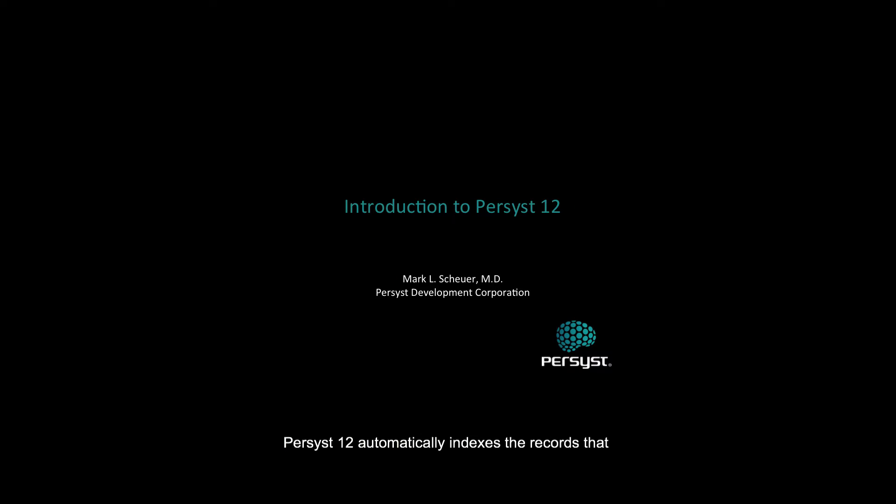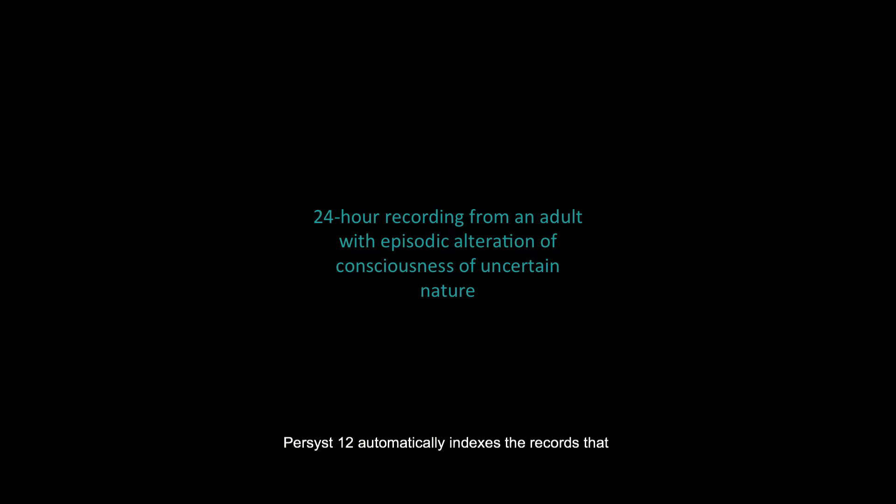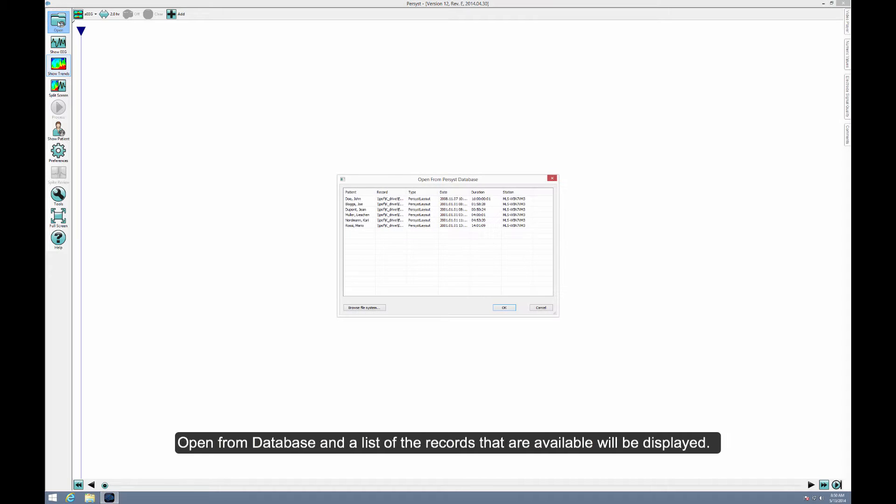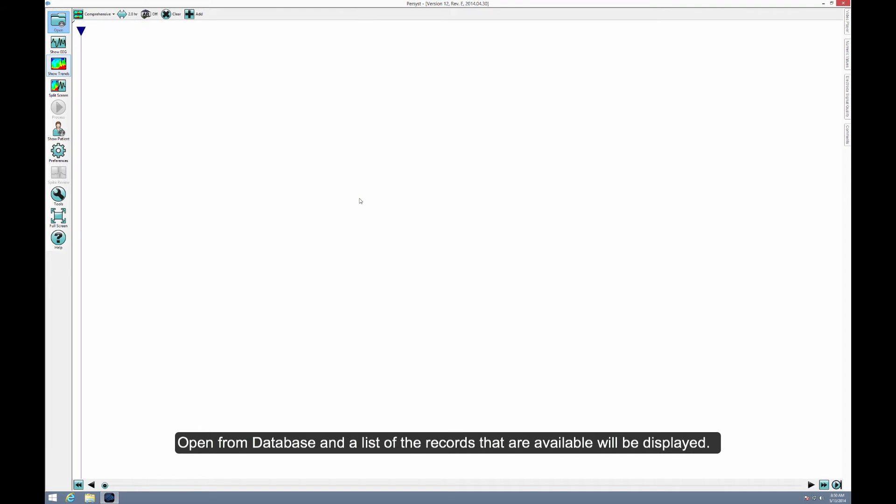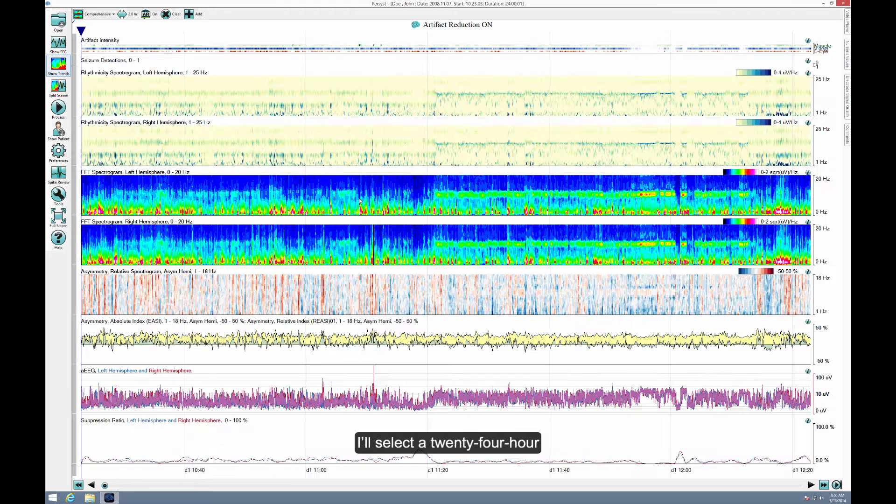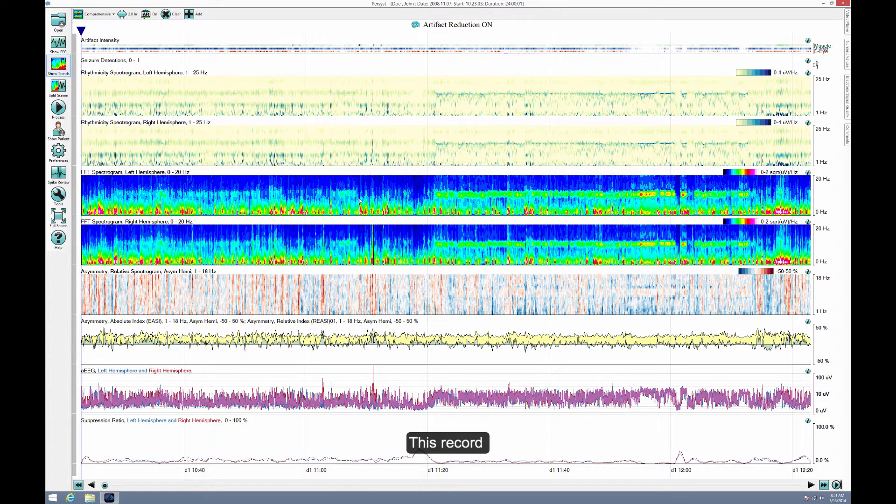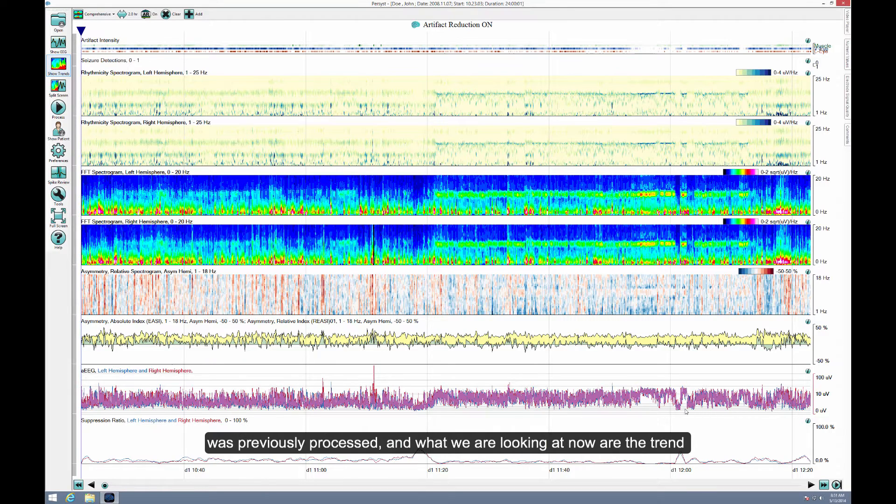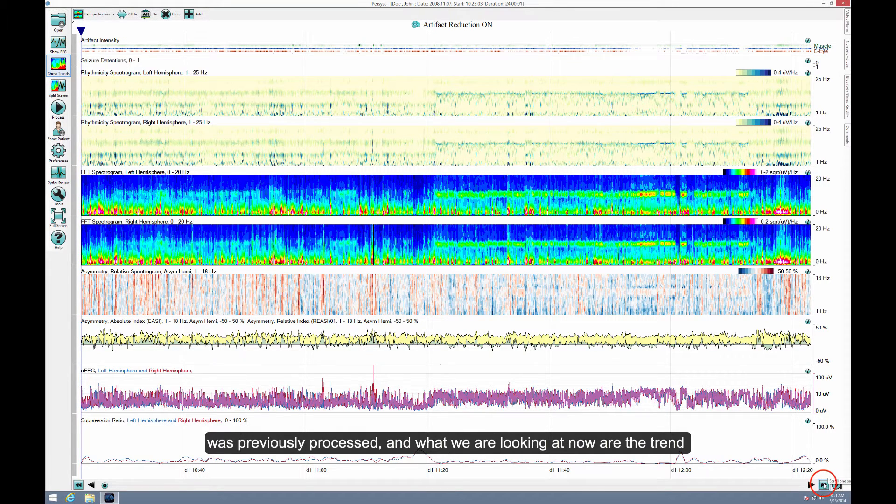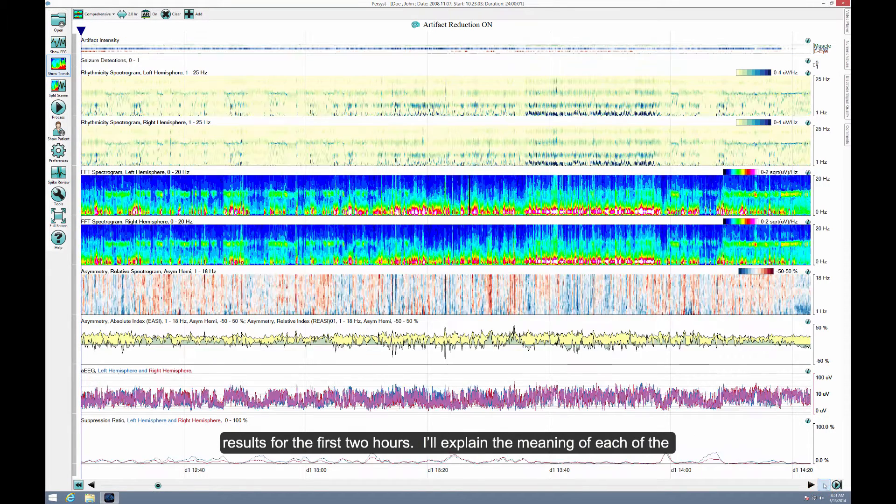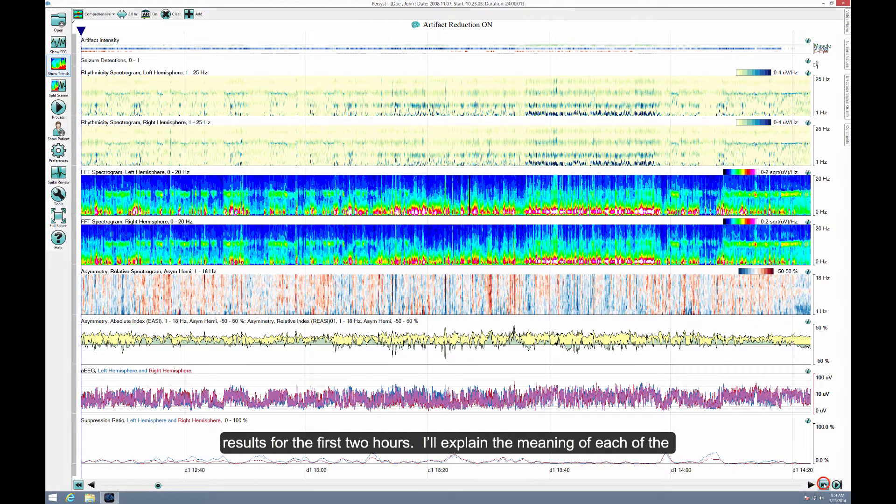Persyst 12 automatically indexes the records that are present in your environment. To open a record, I'll select Open from Database, and a list of records that are available will be displayed. I'll select a 24-hour recording for review. This record was previously processed, and what we are looking at now are the trend results for the first two hours.